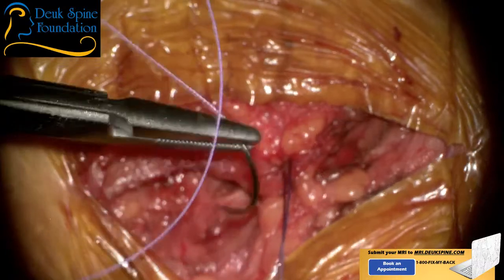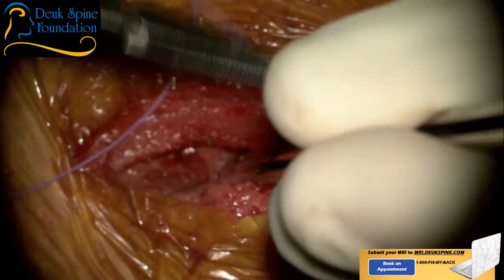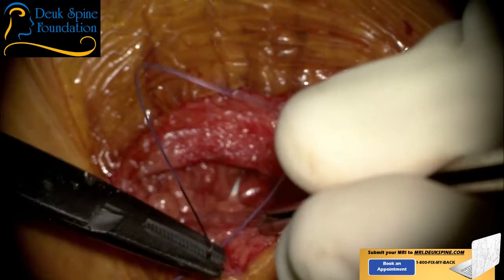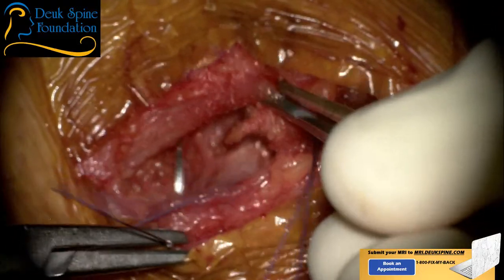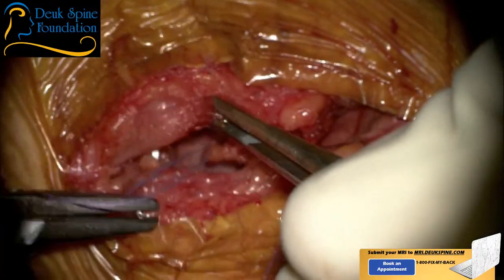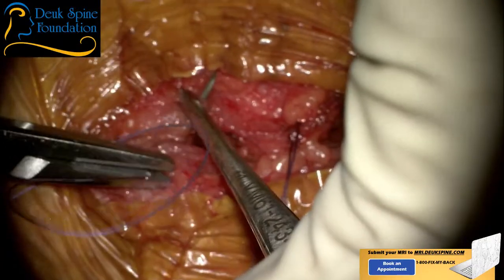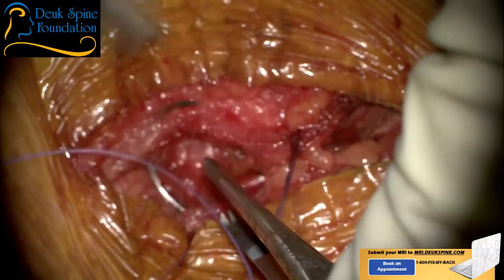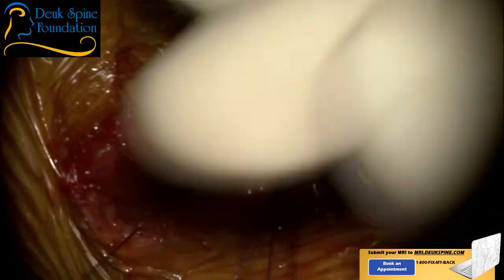I would grab the muscle. Yeah, you want to grab it and just kind of pull it towards you gently. Try not to get the subcutaneous tissue. Yep. And then on your side, yep. Not too deep because you might get a vein in there. So just where you can see. You're doing good. That's it. Perfect. Let me have it. Get the needle. Give it back.